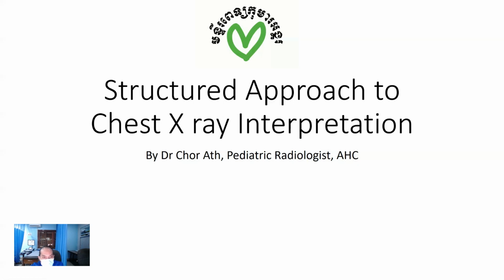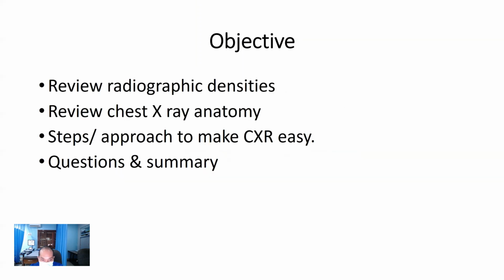Hello everyone, today I'm going to show you a structured approach to chest X-ray interpretation. Objective: we have only three objectives. First one is to review radiographic density. Second, review chest X-ray anatomy. And third, a step approach to make chest X-ray easy.